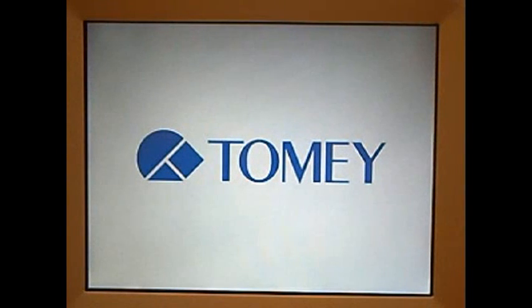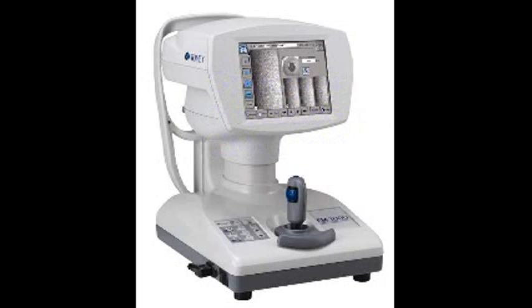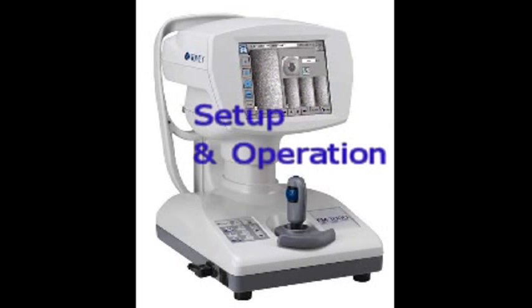Tomey Corporation presents basic setup and operating instructions on the EM-3000 specular microscope. Plug in the unit and turn it on.